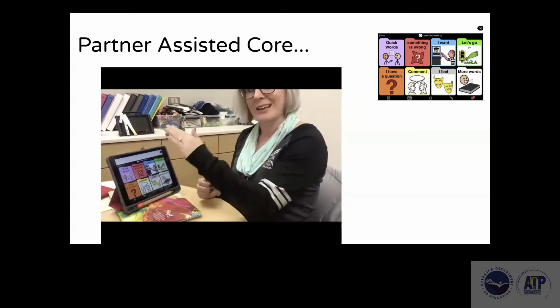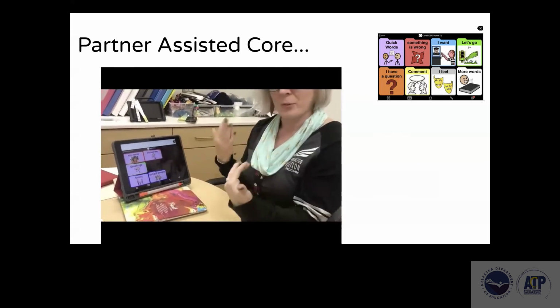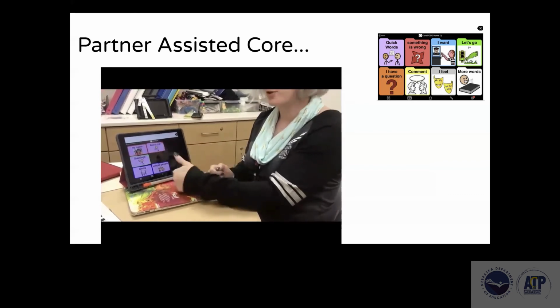And if he doesn't get it that first time, then I go back and I say, you know what, greetings is under quick words. So go to quick words and I open it up and I tell him, remember, we're listening for greetings. So do the same thing, start at the top. Start with, is it in my name? About me? He gives me yes or no.